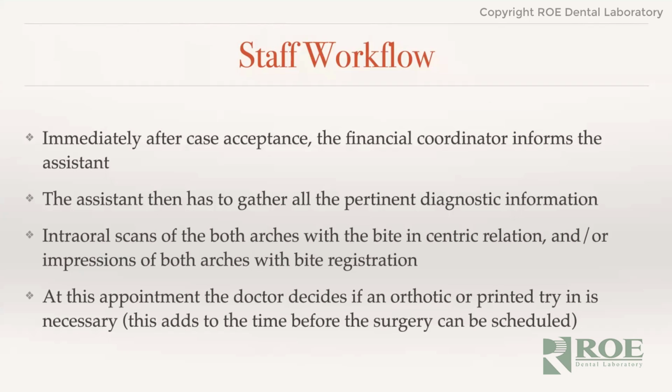A lot of times the assistants have a hard enough time figuring out where the bite is supposed to be. And it's at this appointment that the doctor decides if an orthotic or printed try-in is necessary. And if so, then we have to let everyone know that there are going to be extra appointments before the patient can be scheduled for their final surgery.